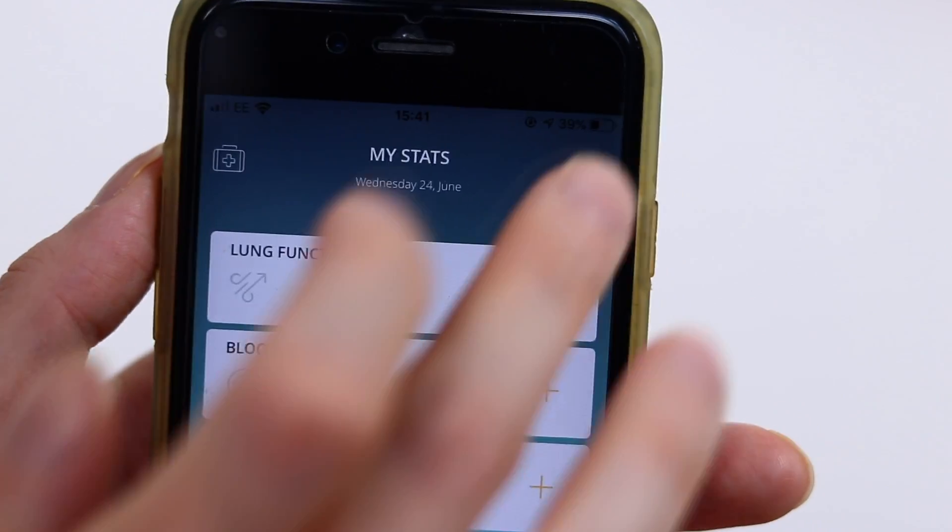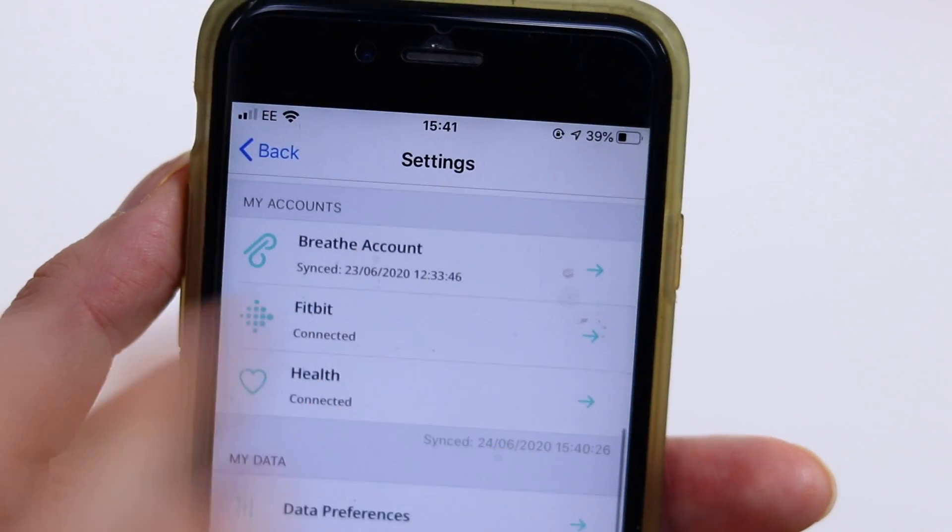If you're happy with how it all looks in the Fitbit app, move over to the Breathe app and make sure your Fitbit account is connected. In the Breathe settings page, you can easily tell if you're connected because the icon will be green and you'll see the word 'Connected'. If you're not connected, tap the tile, hit Connect, and sign in with your Fitbit account. Remember, if you're doing this for the first time you'll need to give the Breathe app permission to access your data.